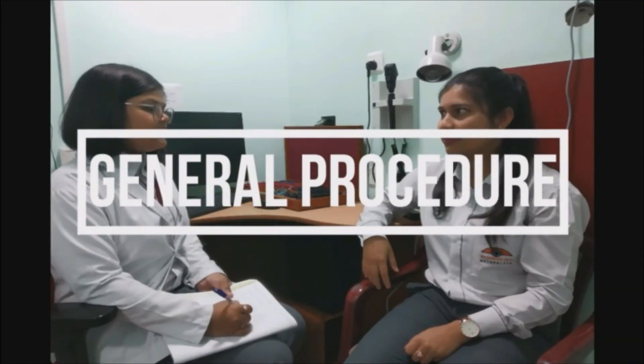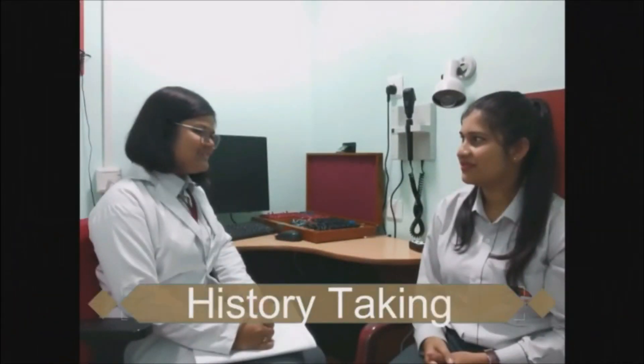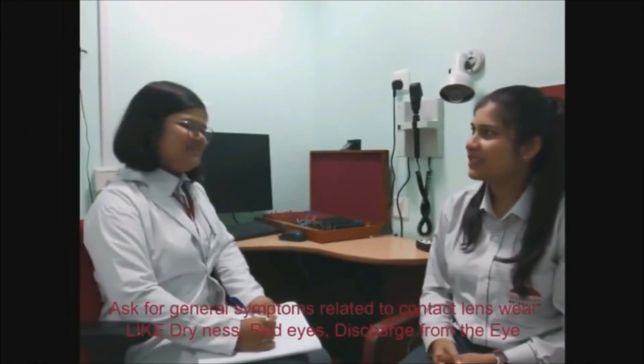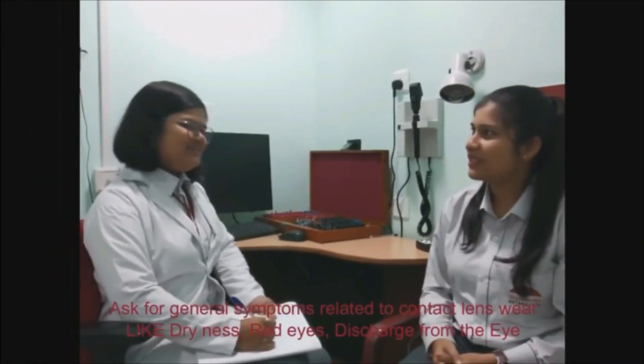General procedures include history taking. Here we take general history, ocular history, and medicine history.